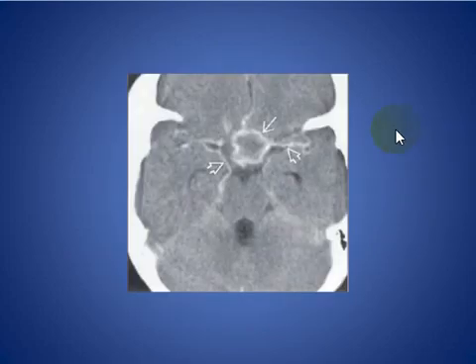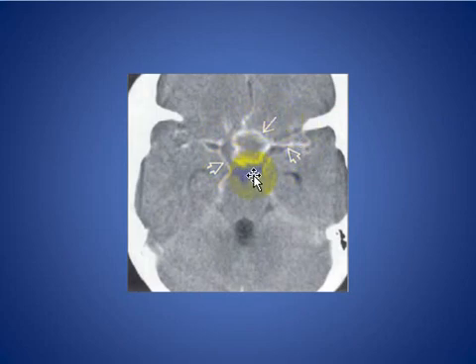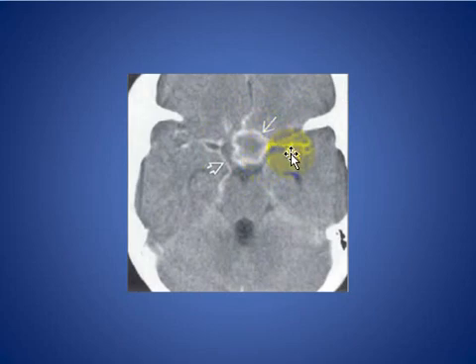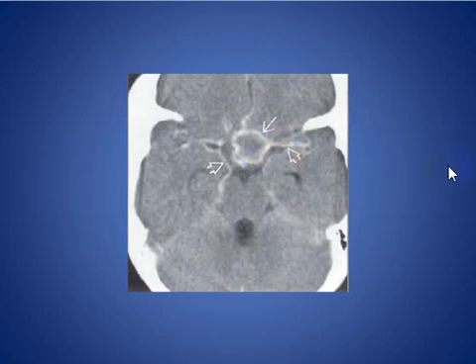Here is another ring-enhancing region in the suprasellar cistern and sylvian fissure in a patient with TB meningitis.